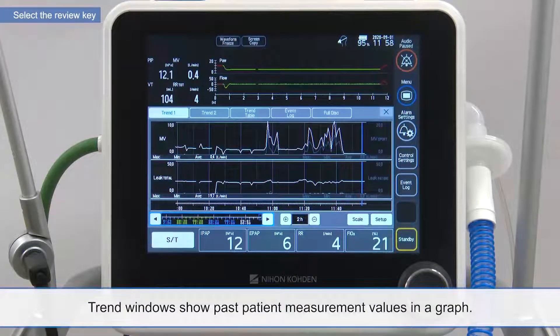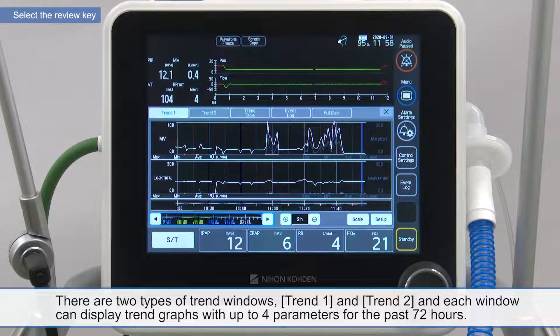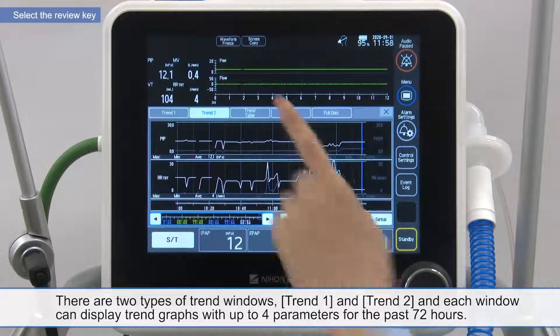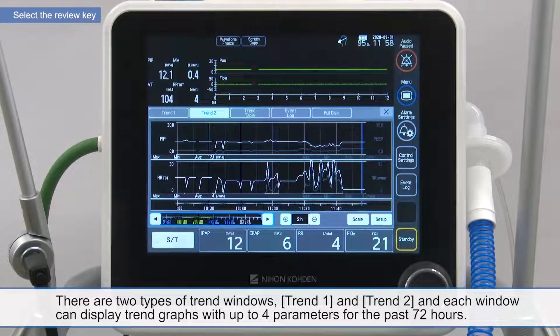Trend windows show past patient measurement values in a graph. There are two types of trend windows, trend 1 and trend 2, and each window can display trend graphs with up to four parameters for the past 72 hours.